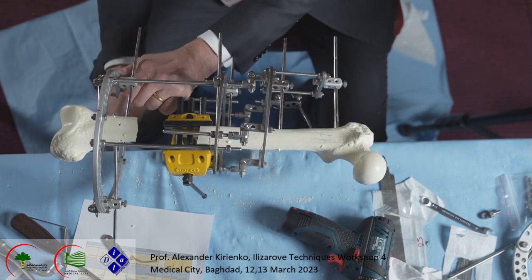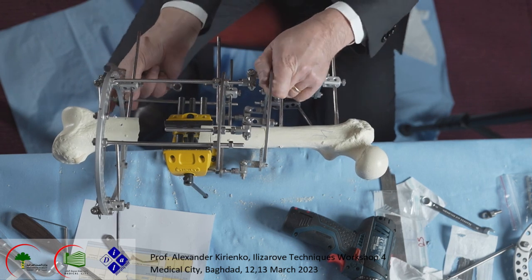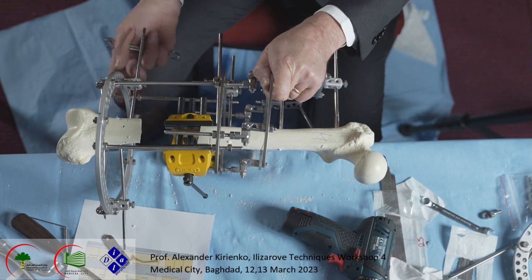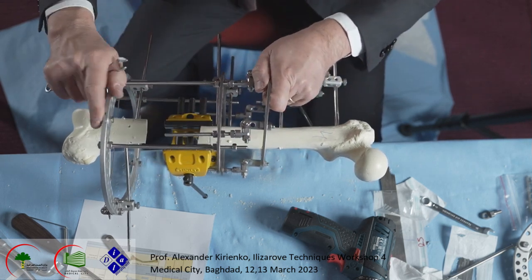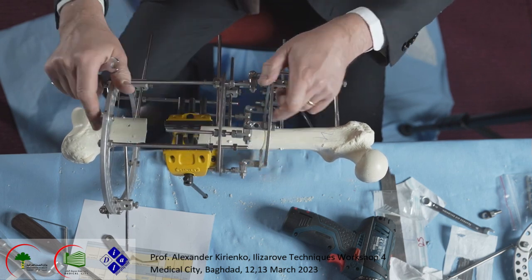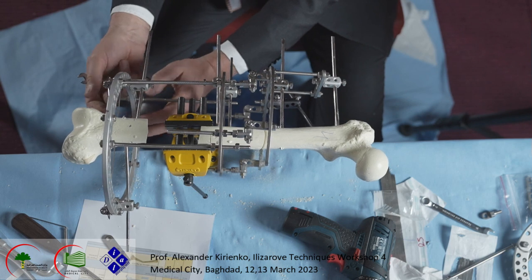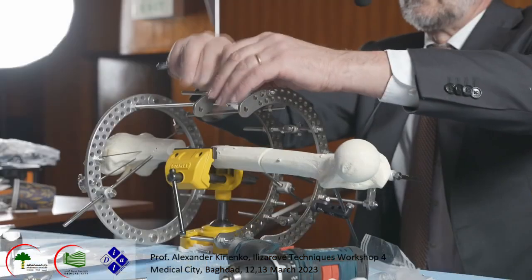I may do it here. And this way the defect becomes smaller and smaller. Here, like this. We continue to do this slowly.